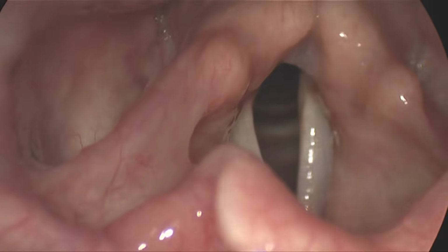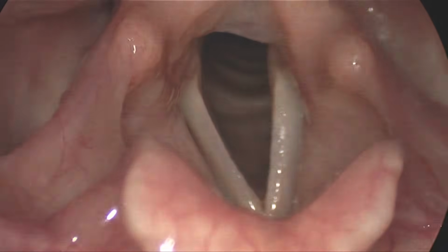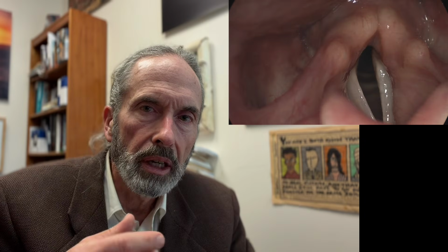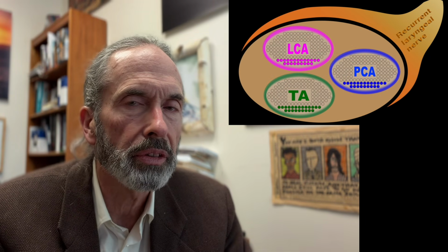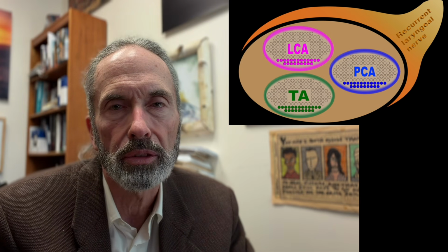So here's the video. The patient's breathing. We saw it moving around or jumping around. How are we going to get to what's going on with that? If we look here at the LCA, one possible explanation for this incomplete motion is that there's been a pressure injury to the nerve and all of these branches are weak, but specifically maybe the LCA branch is weak and only a few fibers are getting the signal to it.